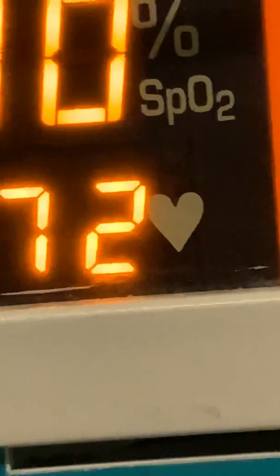Especially since I'm so mobile. So, looking at this: this is my oxygen saturation and heart rate. The top is my oxygen saturation, the bottom is my heart rate. This PI, or perfusion index — I don't have good perfusion in my extremities, so it is very low.